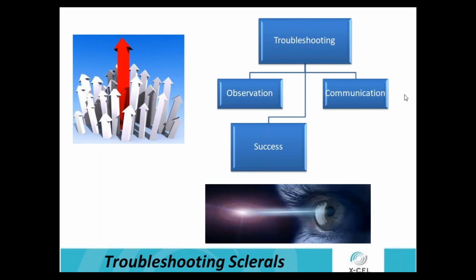So we ask these series of questions, and I think it's a good idea as a practitioner to probably form some questions around your fitting process to ask the patient, because this helps you. Troubleshooting is coming after the fact. It's after something has happened in the fit, and now we need to solve that problem. But there's so much we can do in the front end to take care of those problems if we are communicating properly, and if we are observing something and making the right decisions as we go along.